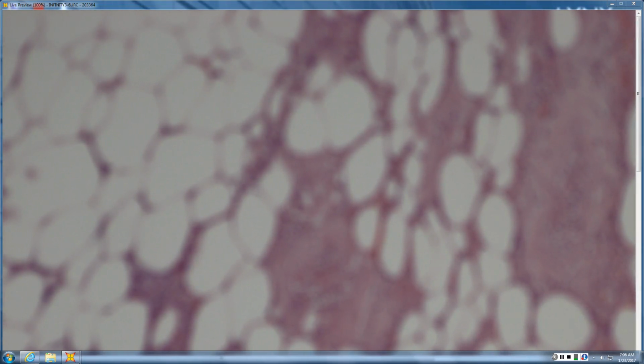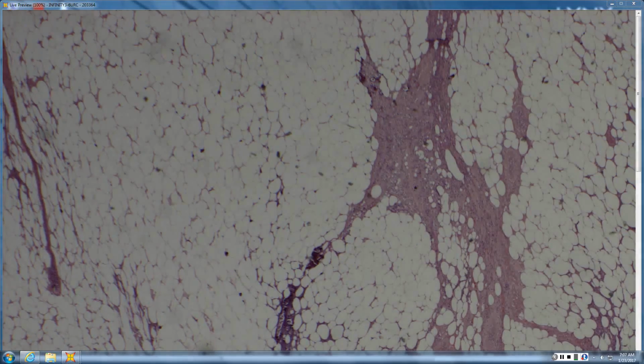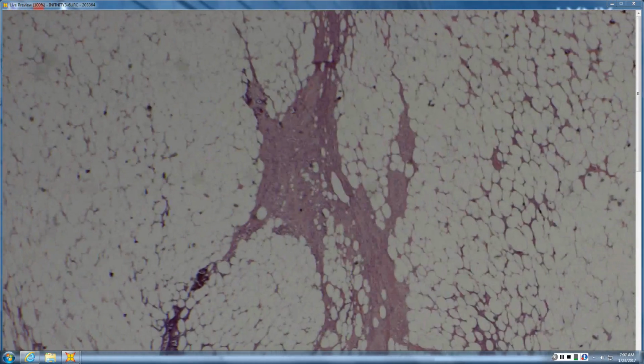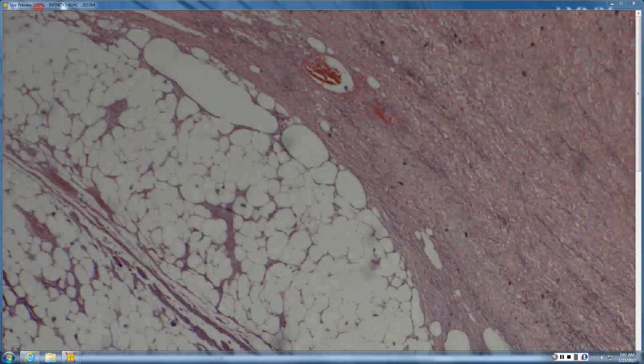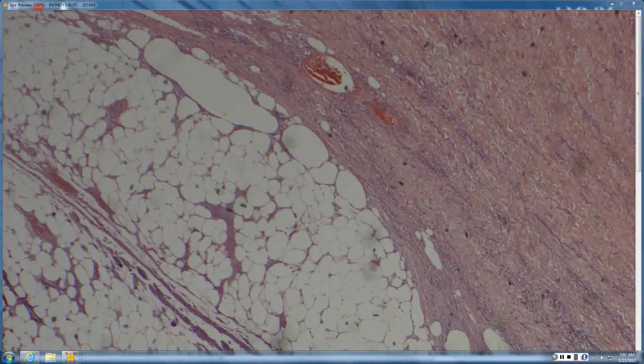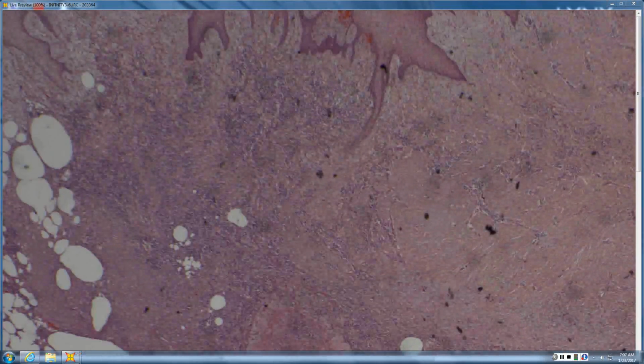You've got calcium deposition all in the walls of small vessels. None of these are medium caliber vessels. And let me go back to scan. A lot of times with this, you'll see areas of necrosis. To me, this fat looks like it's dying there, and up top as well. And this looks like an area of necrosis, but it's hard to know timeline-wise when they biopsy this.